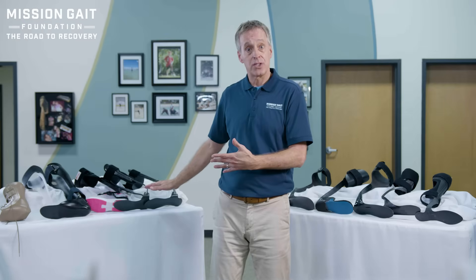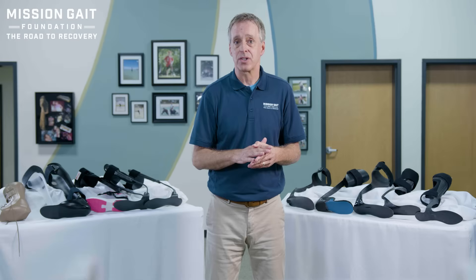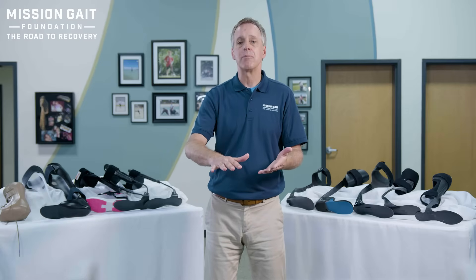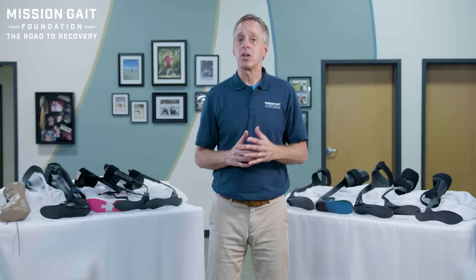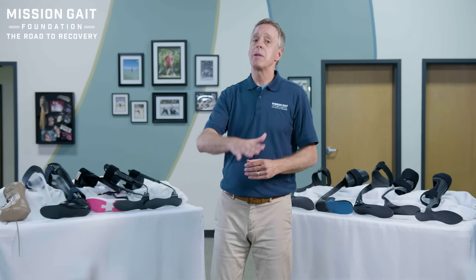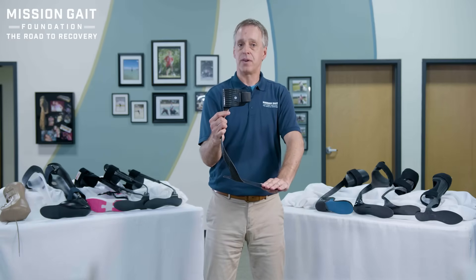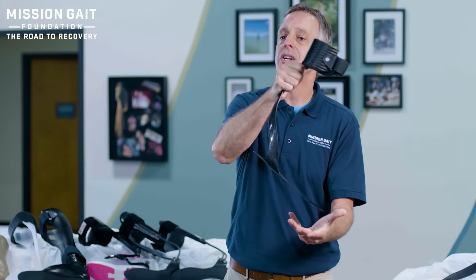But if you have tone issues, that lift of the foot could cause a tone reaction and create a stiffening of the leg. So you have to make sure, when you put these braces on somebody, to have them walk with you and see if you get a tone reaction when that brace lifts the foot up harshly. Progressing on in carbon fiber, we're looking at options that are non-articulated and are not going to be pre-loaded lifting your foot up.